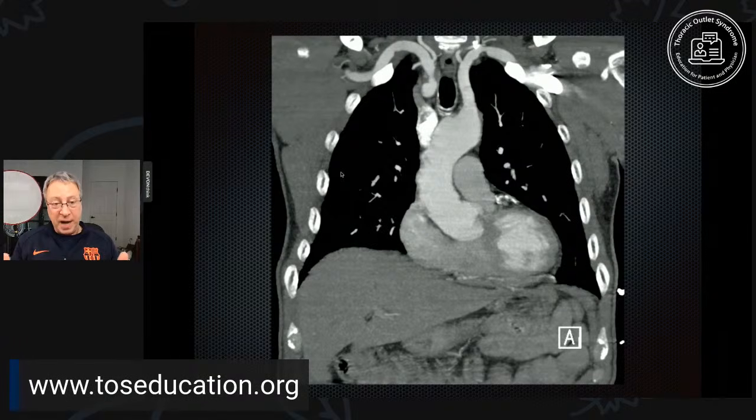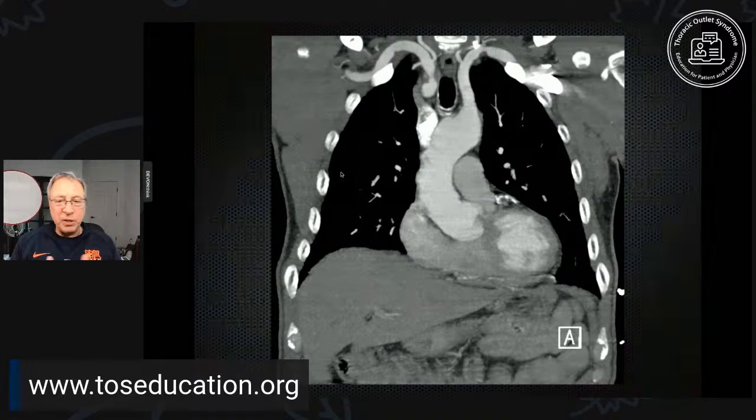If you inject dye, like we do for an arteriogram, you can get pictures like this. We see a curved, large vessel right in the center of our picture. That's the aorta, the large artery in the body. And we see some arteries branching off of it, going up towards the top of the image. These are the subclavian arteries on each side.